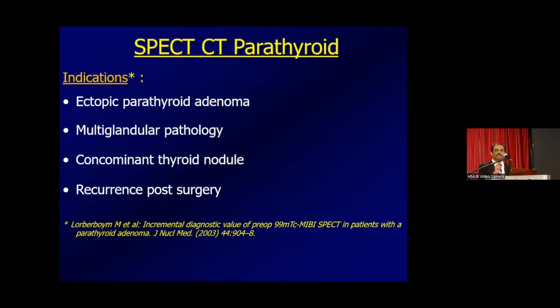So what are the indications for SPECT-CT? To take care of the pitfalls of planar imaging, we come with SPECT-CT techniques, and these are the established indications for SPECT-CT.